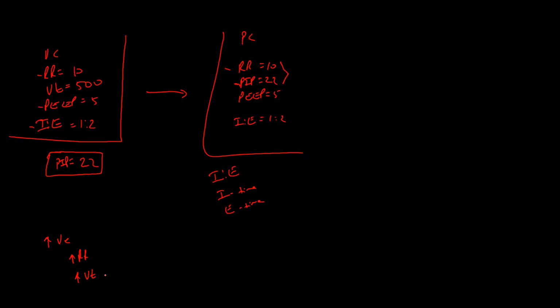Okay. Now I have a question. Now, at the facility that I'm at, I'm used to always having patients in volume control, but there are times that they're getting switched to the pressure support. Pressure control mode. Well, pressure support or pressure control? Pressure control, I'm sorry. Okay, no, that's all right. I'm just making sure I'm following you. But I really don't get the concept of when it's best to switch them to the pressure control mode.